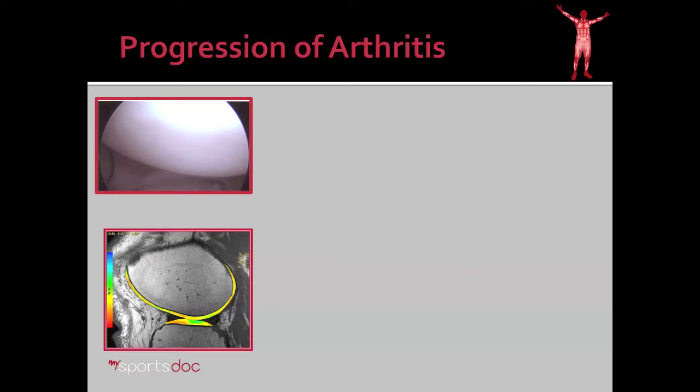Here we see on the left an arthroscopic picture of the inside of the knee. This is the medial femoral condyle, and this white shiny substance is the cartilage lining the joint — this is a normal healthy knee. You can see the corresponding MRI; this is also the medial femoral condyle. The highlighted area here is the cartilage layer that lines the bone, which lies underneath, as seen in this arthroscopic picture.